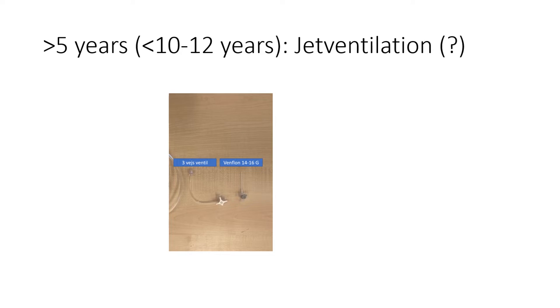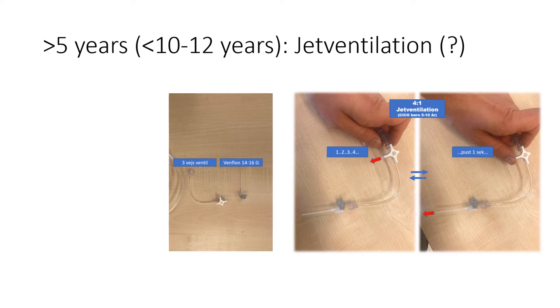So what you'll need here is that you have your needle in the airway. You'll have one of these three-way stopcocks, I think it's called in English, trevägskran in Swedish. And what you'll do now is connect this to your usual oxygen supply, just 15 liters of oxygen, and then you'll make this stopcock open here. This means that you can use this as a ventilation device, so that every time you hold this, then you will blow, and every time you don't hold it, then the air will go out the easiest way here.